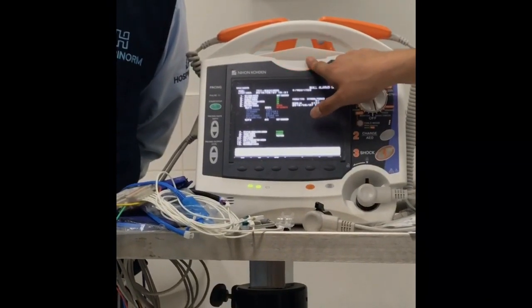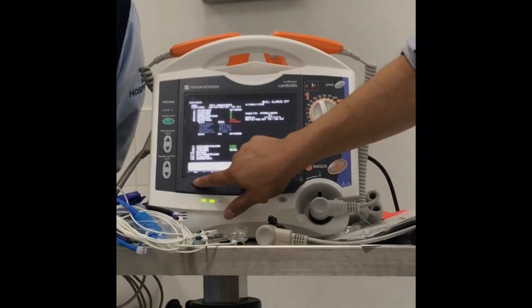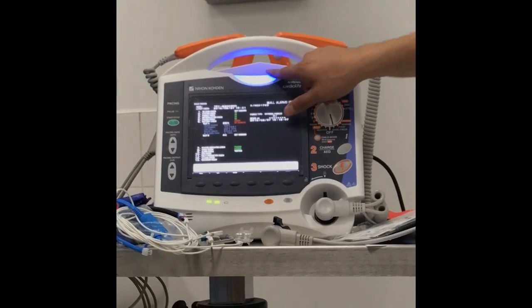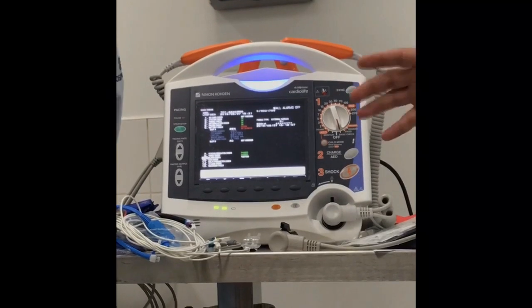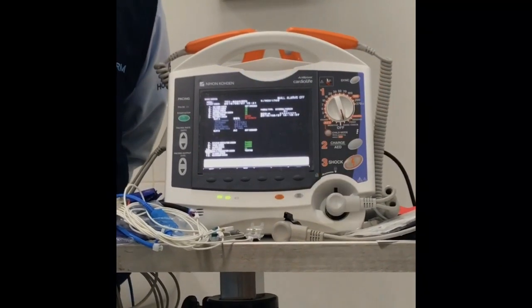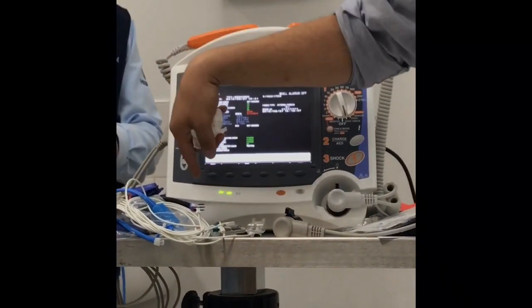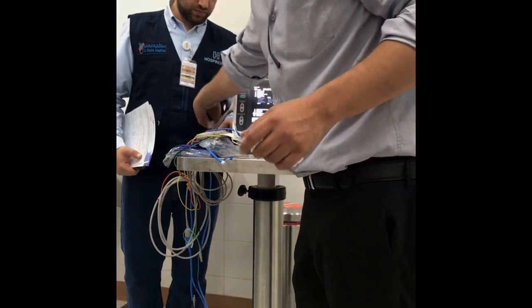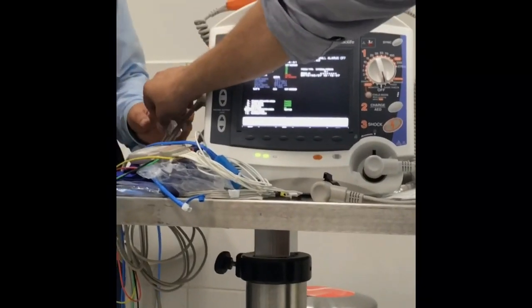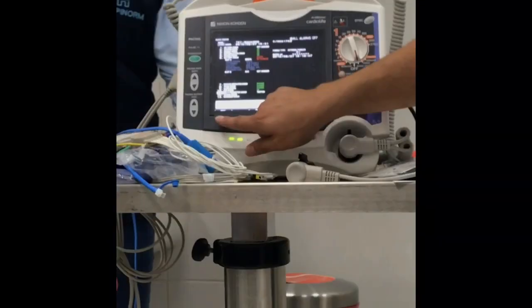Then connect the ETCO2 adapter. You need to check the ETCO2 adapter and sensor. I have to connect one adapter, by the way. We should keep one open for the check. The sensor, if it is also next, you need the ETCO2 also. And it's giving me the 12 lead, okay. Press the record stop key. Where is the record stop key here? Is the machine recording? Yes.